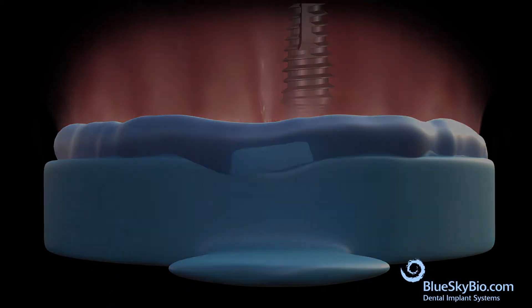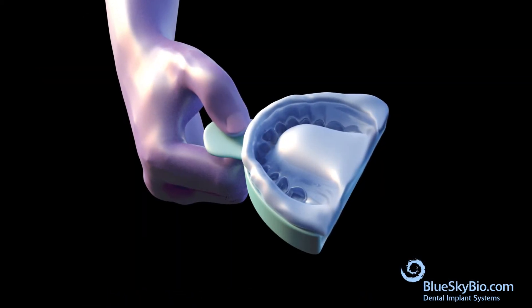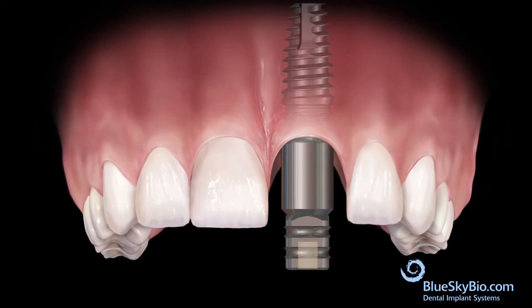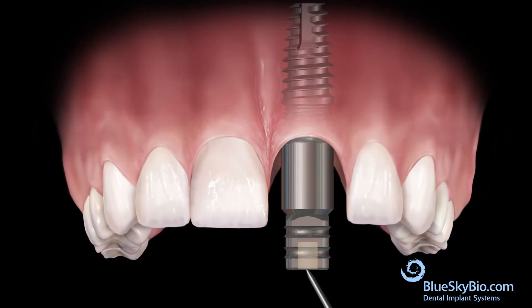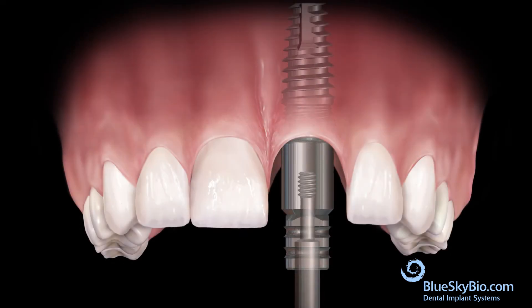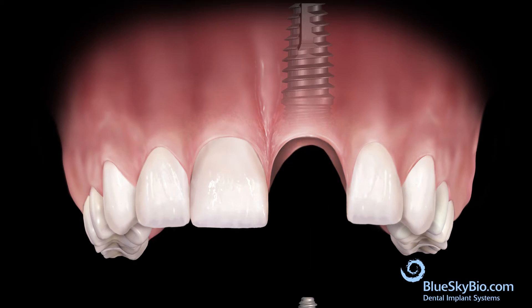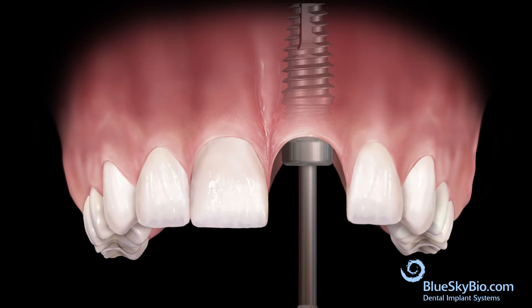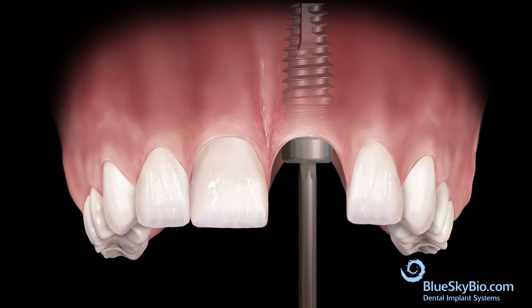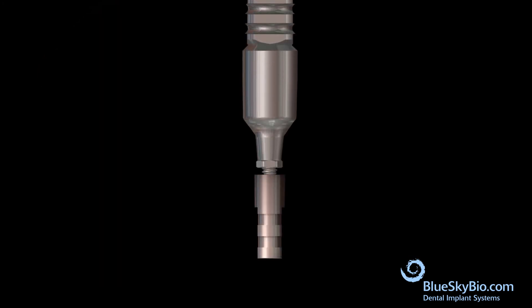Take an impression after the impression material has hardened. Remove the impression, then remove the multi-purpose abutment from the mouth and reinsert the healing abutment.